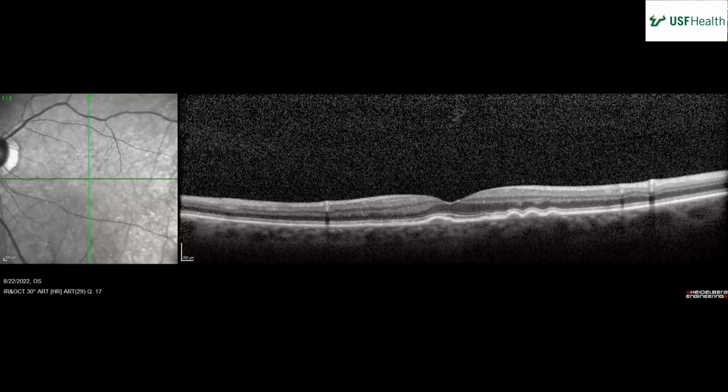Okay, so we're at 6 minutes there. And then what would you call this area here? So you think that's leaking, pooling, staining? I would say leaking. It's leaking, but it does look like it's leaking some into a fluid space. So it's also probably pooling. A little challenging. That's probably kind of classic. That's an RPED.